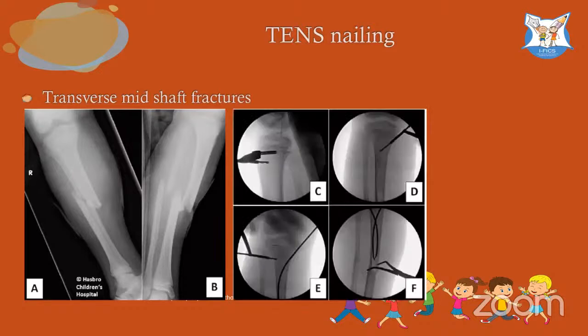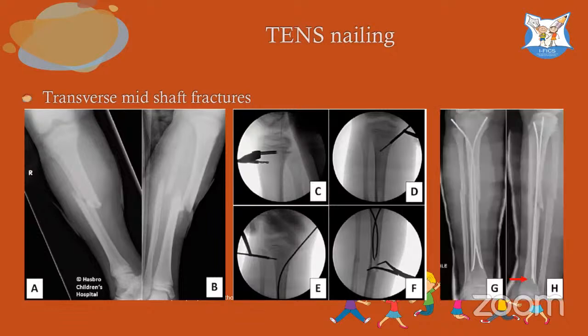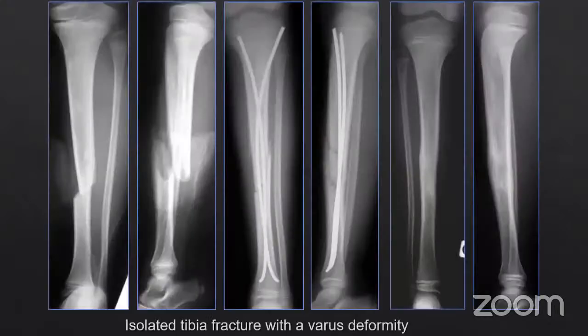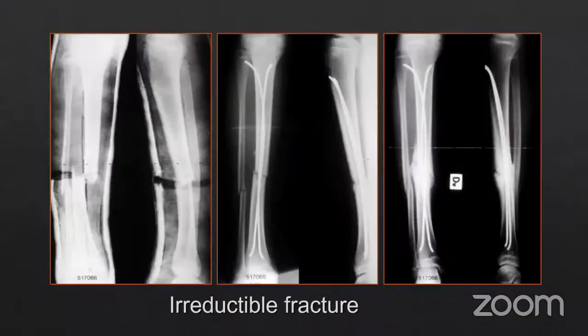Transverse midshaft fractures sometimes may require elastic nailing, okay, to stabilize them. You can use this and couple that with a slab or a cast. Unstable fractures which need to be stabilized in older children. Okay. Isolated fracture which is drifting into varus, which is not correctable because you have no control. When there is an intact fibula, sometimes because of the muscle activity, which is all anterolateral, there is a drift of the fracture and you may end up with an unacceptable varus deformity. So in these situations, you may consider elastic nailing.